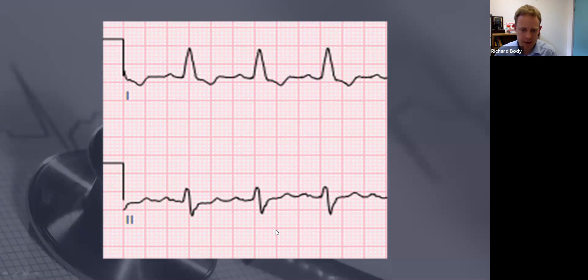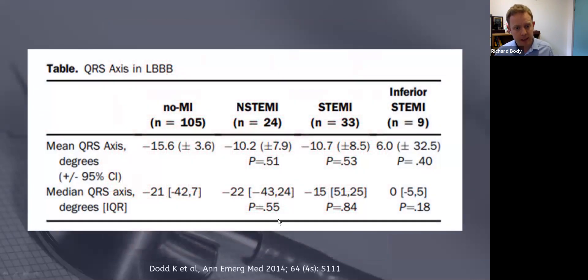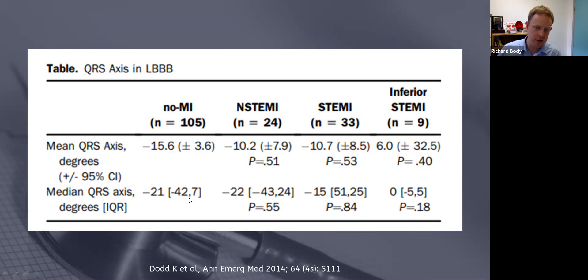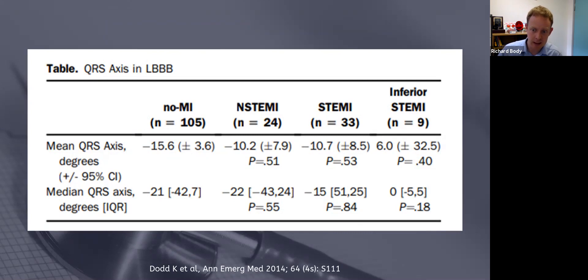If it's doing that in lead 2 it's left axis deviation; if it's doing that in lead 1 it's right axis deviation. So we've got left axis deviation in this ECG and left bundle branch block. We often do get left axis deviation in left bundle branch block and it's normal. There's an abstract from Ken Dodd in Minnesota from Steve Smith's group which shows we do have a slightly leftward axis in patients with left bundle branch block. In patients without MI, the median QRS axis is minus 42.7 - the normal range is up to minus 30 - so over 25% and in fact almost 50% of people have an abnormal left axis deviation when they have left bundle branch block. So it's quite a normal finding.